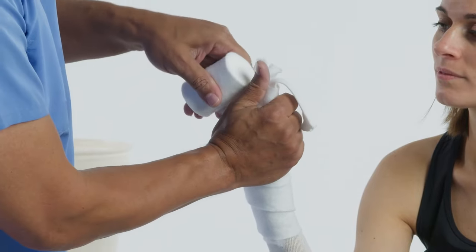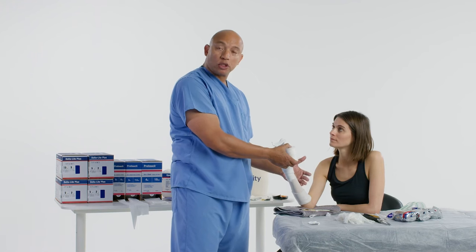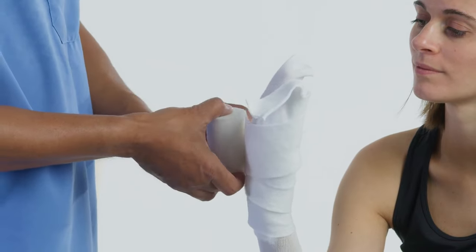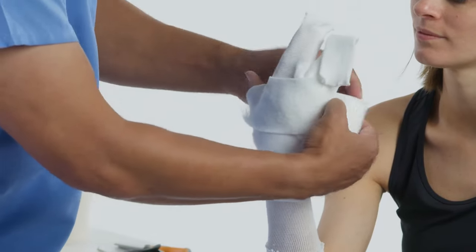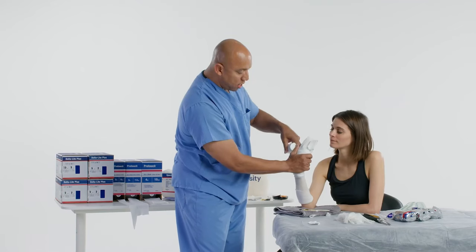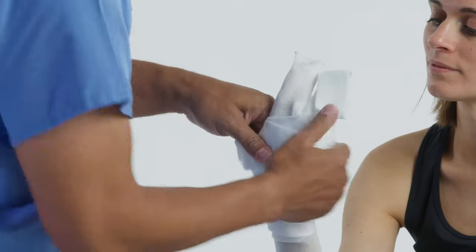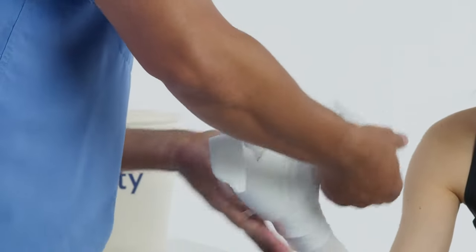On the proximal end, it's going to be the same as a short arm cast — stop it one or two inches from the antecubital space, or so it doesn't touch the biceps when they bend their arm 90 degrees. Now I have the padding on, so let's go ahead and cross it over on the back side of the hand. We want at least a minimum of two layers, max of four.